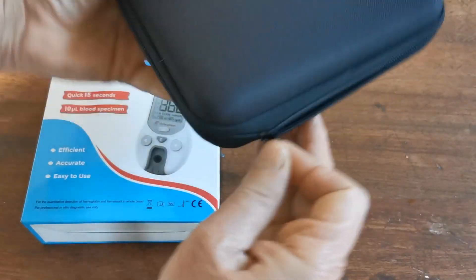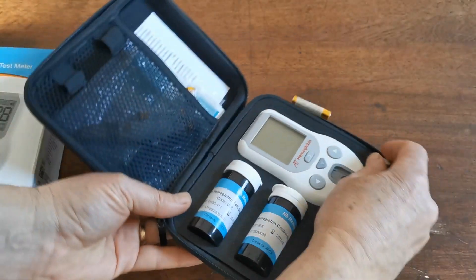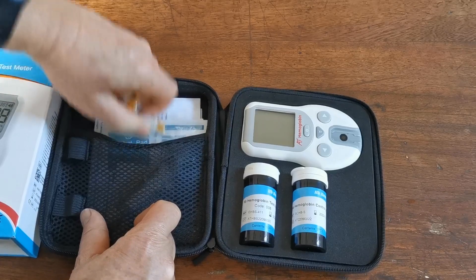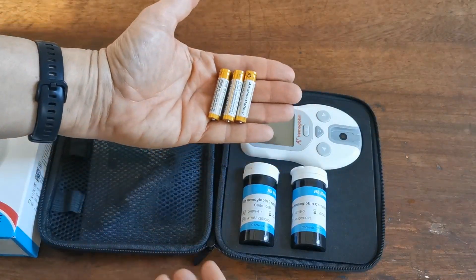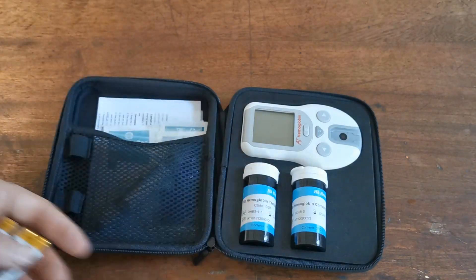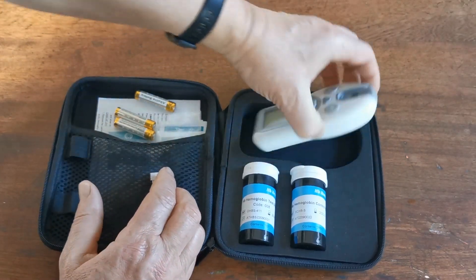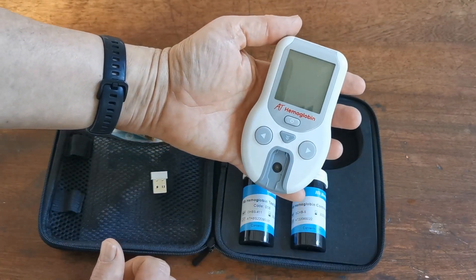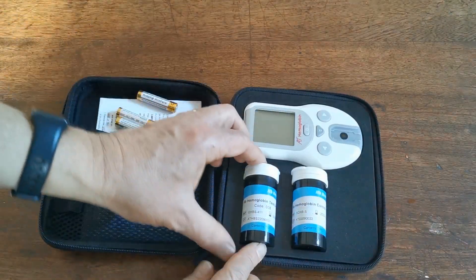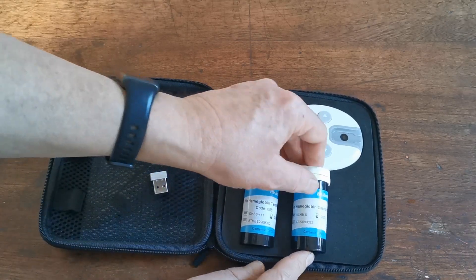Inside this very well-manufactured carry case, let's show you what else you get. One of the batteries has gone astray — these are usually strapped together — but you will get three AAA batteries. They're standard alkaline batteries, easy to purchase and replace, and they'll be good for around 2,600 tests. This is the digital meter itself: a very well-manufactured, robust AT haemoglobin meter. You also get a carton of 10 haemoglobin test strips and some haemoglobin control strips.